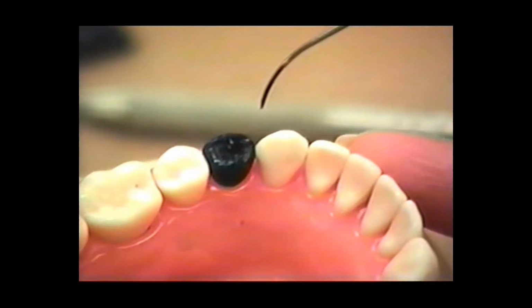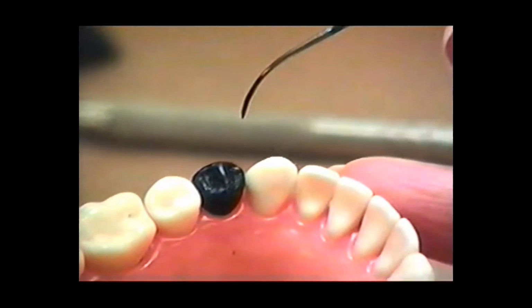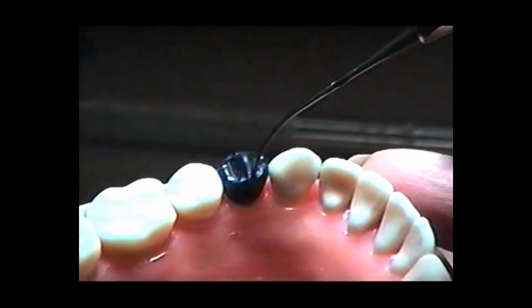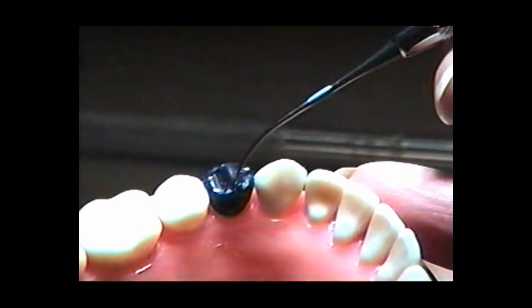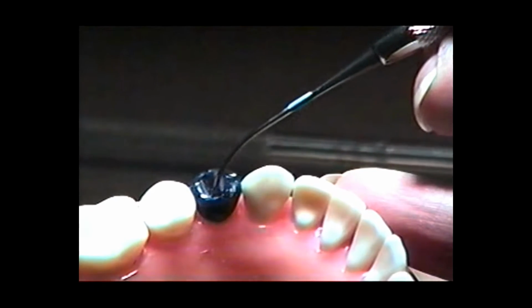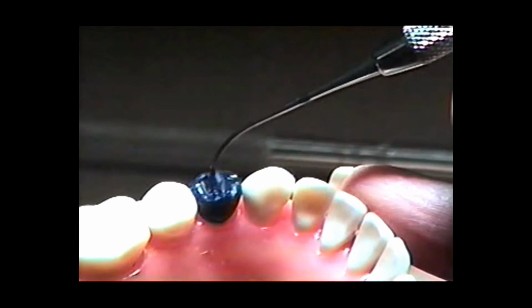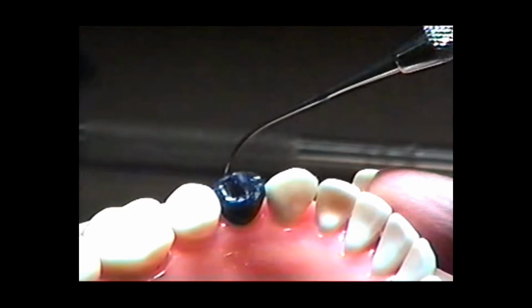I don't know if you can see it at all. Maybe if we put the light on, we might be able to see just a tiny bit better. There we go. So what I've done is, just by one little addition of wax, I've got something that looks a lot like a triangular ridge. And it's going to have to be carved back a little bit. But at this point, I just want to make sure I have enough wax on there so that as I go to carve back, I have something to carve back with.